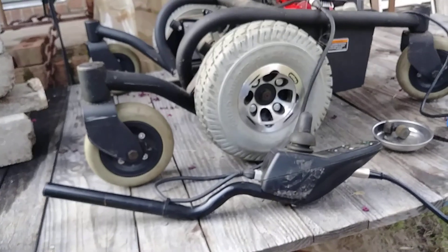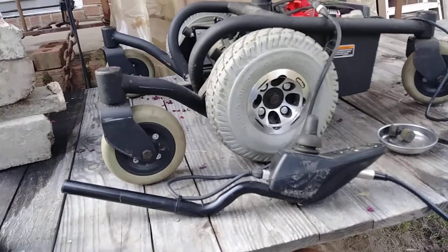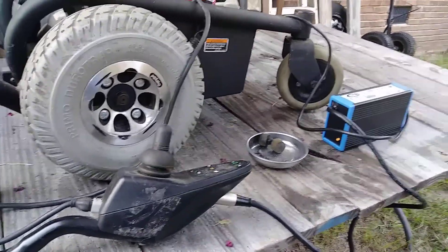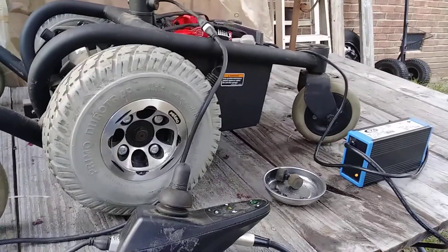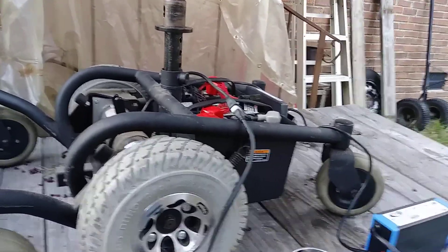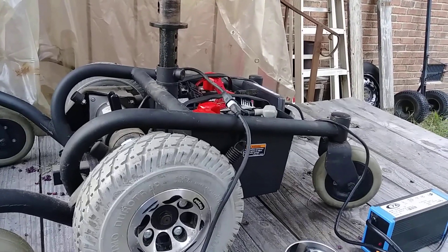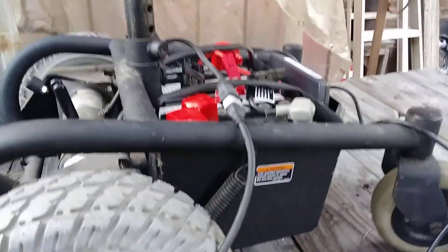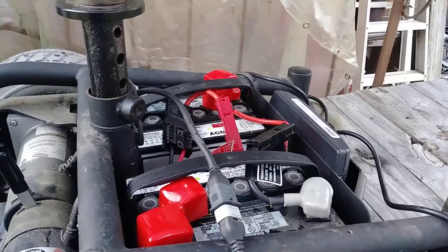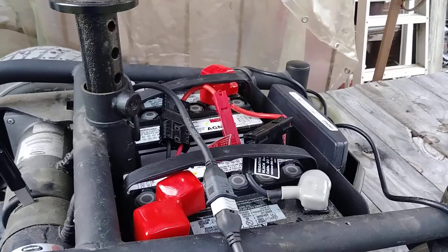Hey, what do you expect for something that's free, right? Mr. George the shade tree fix-it man. Our next step is, if it don't work, I plan on trying riding lawnmower batteries. I've got one in my Red Eye — my play toy — and a new one in my grass cutter. I'll try those two batteries in here; they hook in series, which means two 12-volt batteries in series gives you 24 volts, and this is a 24-volt system.